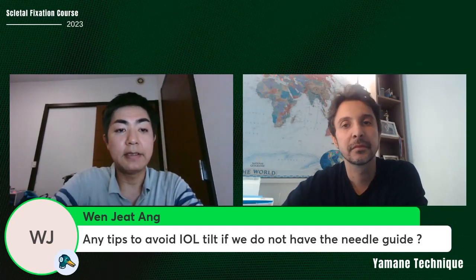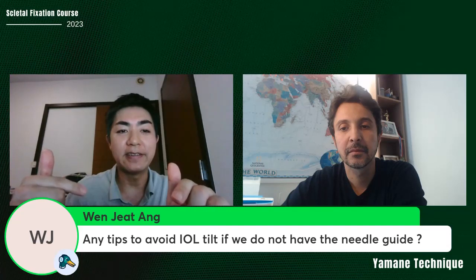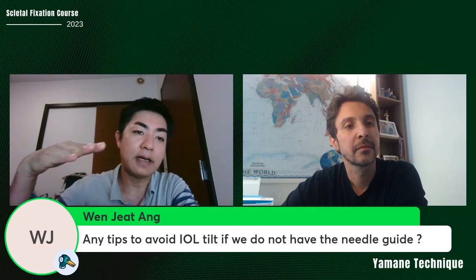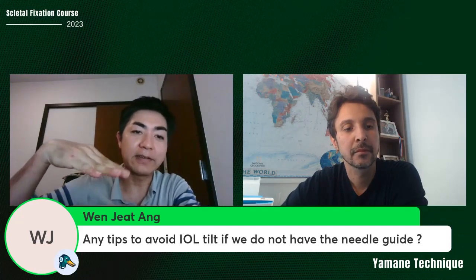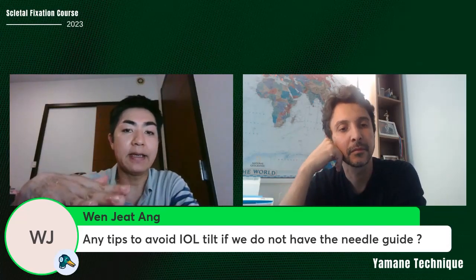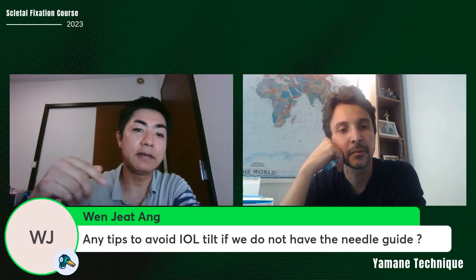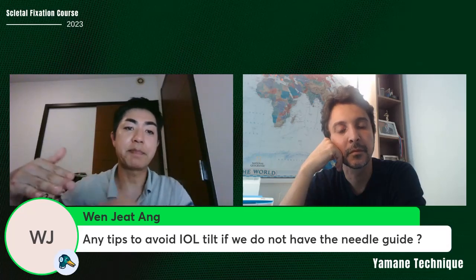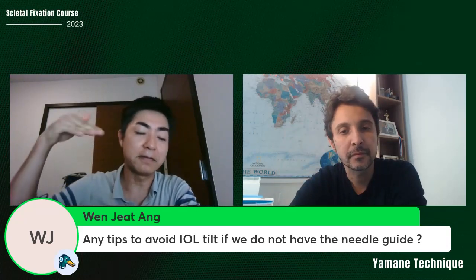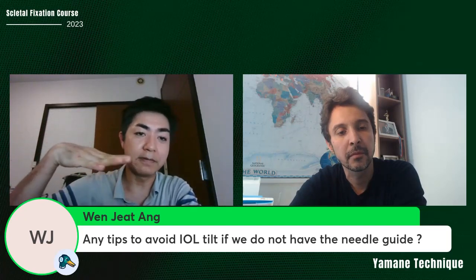Yes, you should symmetrically insert the needles, and to control the vertical angle is difficult for most surgeons. So you should keep the eye parallel, and you should insert the needle parallel. In a deep set eye, it's easy to go vertically, go down. So please keep the angle of the needle horizontal.